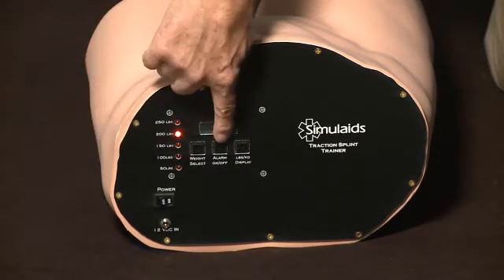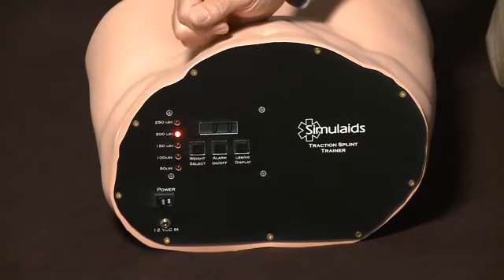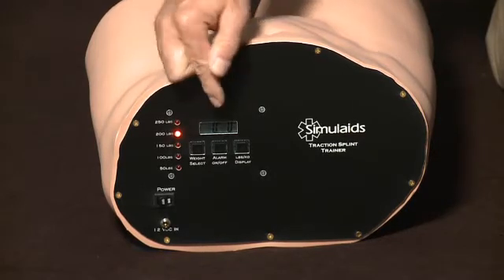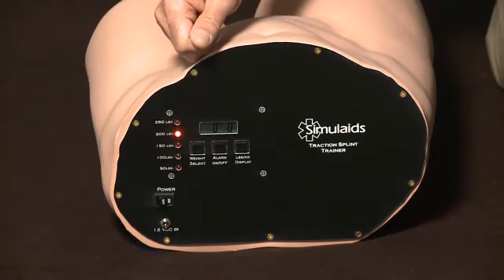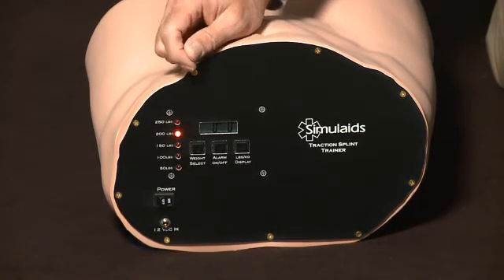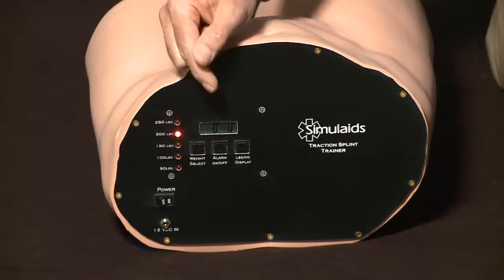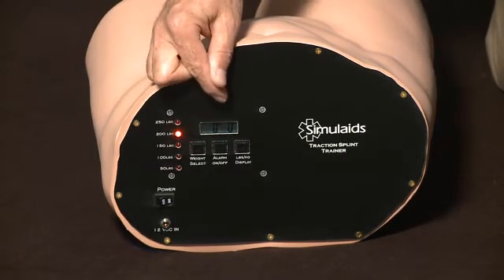You may turn on an audible alarm, which will sound so the student can learn what the right tension feels like. It will beep slowly until the pressure is attained at 15 pounds, plus or minus 2 pounds, and then if you pull farther the beep changes, so you get audible coaching to get the right pressure.